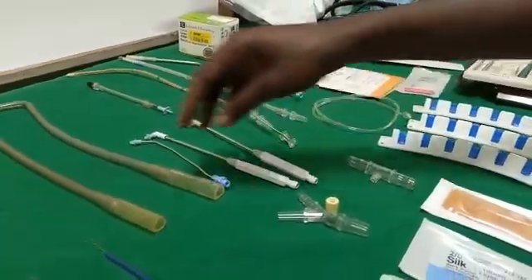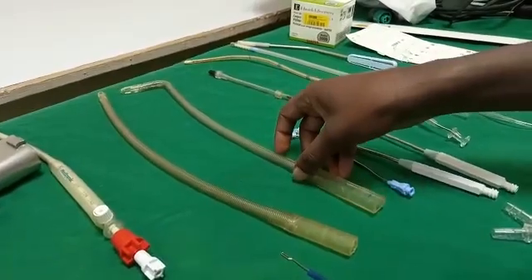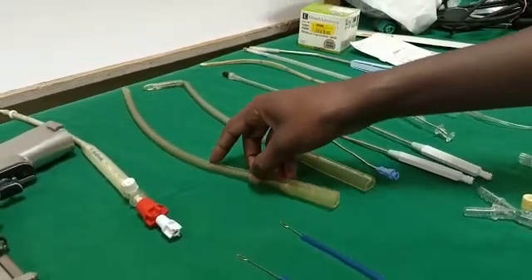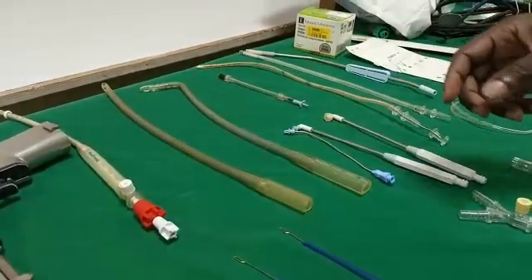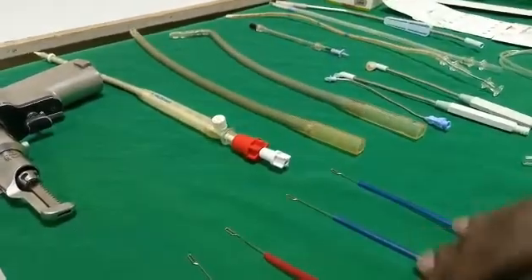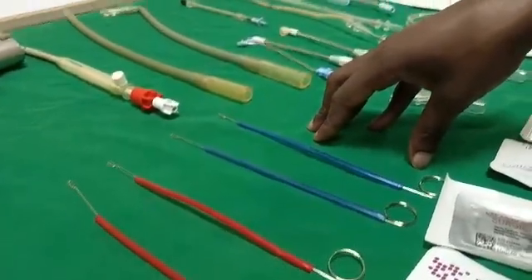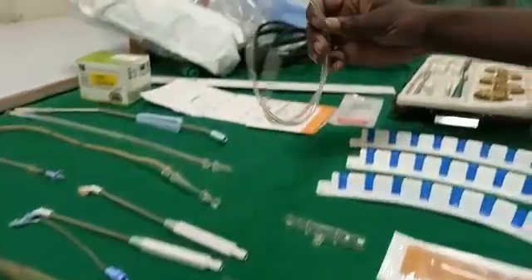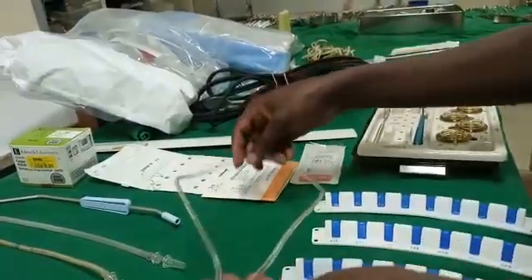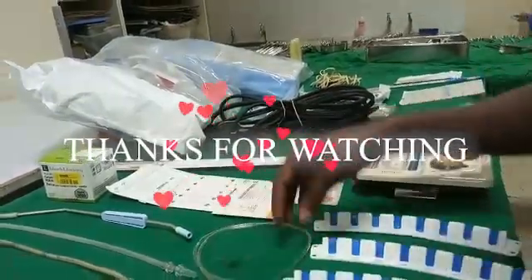We have different cannulas — these are suckers, pump suckers, weighted suckers, and vent suckers. This is the aortic root needle, and we have coronary ostial perfusers at different angles. We have venous cannulas — the straight one we use for the IVC and the angled one for the SVC. We have aortic cannulas in different sizes. Here we have the tourniquets we also use, and this tubing is used to make rubber shods that are used during surgery. Thank you so much, I hope you enjoyed the show.